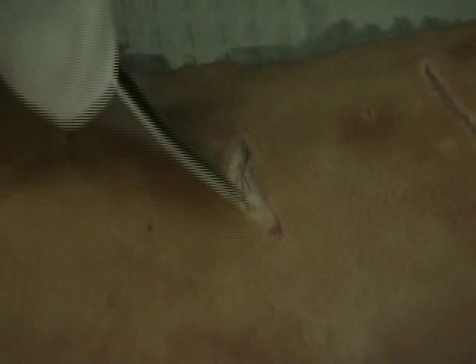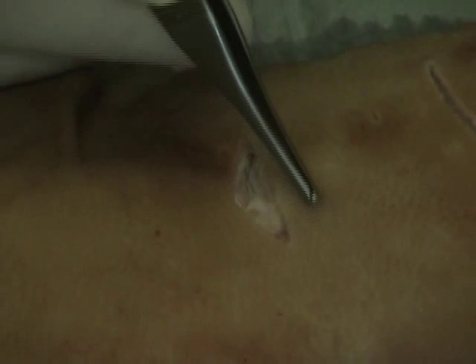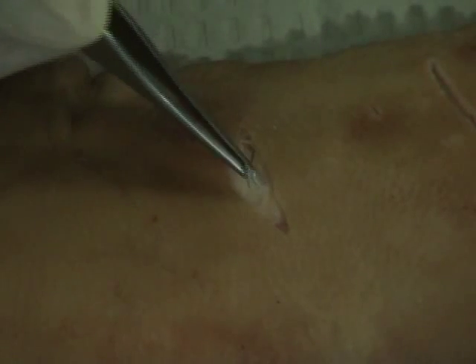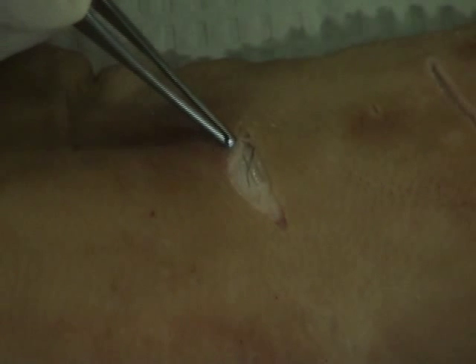If the curvature here is too much and I want to flatten the whole thing, make it less of a curvature, I can undermine this side and minimize, or do not undermine on this side, then I can pull this side down to the other and flatten out, as you can see what's happening actually here. Okay, so we do have that variability. Again, you're playing with the tissue. The ideal scenario would be that this curvature matches the curvature of the patient, so that when they smile or something like this, there'll be a wrinkle line, and this will actually be embedded right in the wrinkle line. That's kind of what we're shooting for.